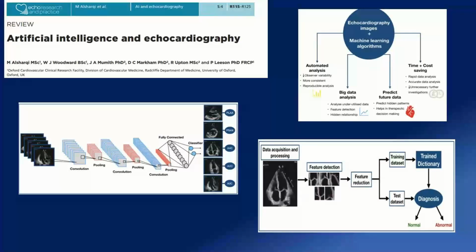So there is a lot of information besides what we see with our eyes. And commonly, a cardiologist or anyway a physician reaches a diagnosis focusing on several parameters, but of course computers can use many more parameters than we can and can improve diagnosis.